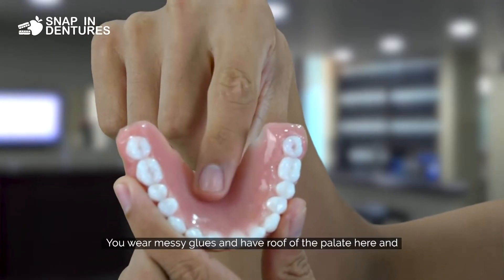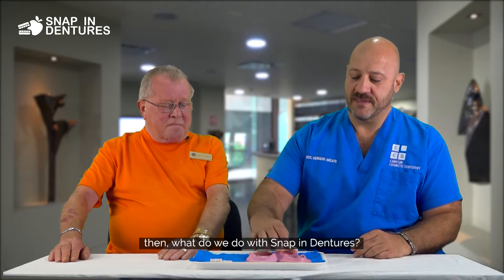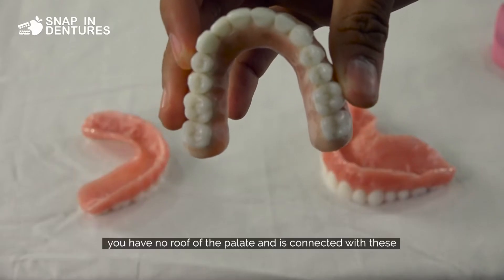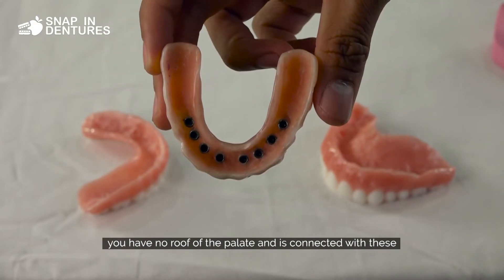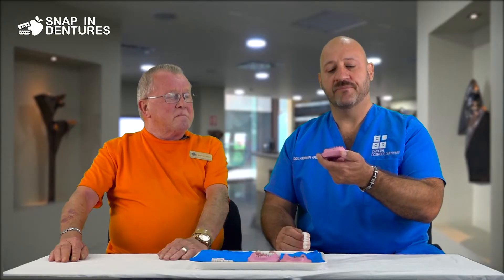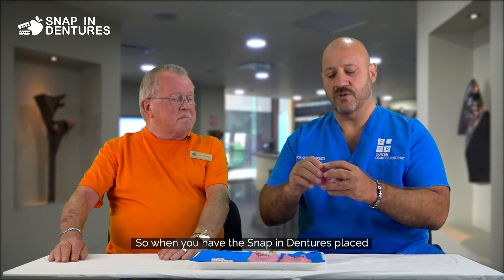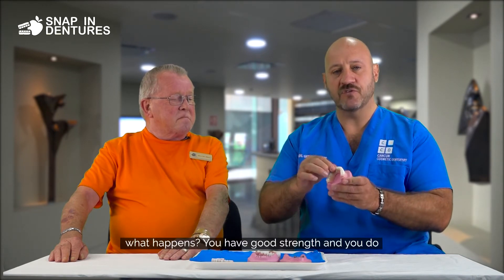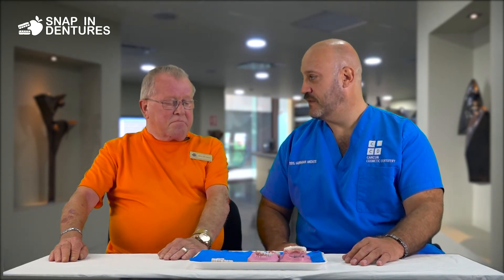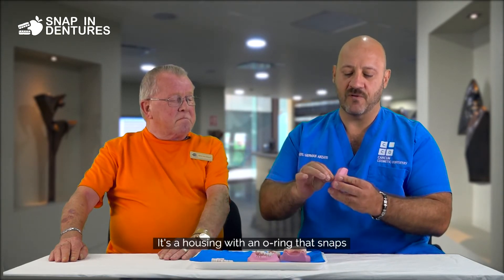When you have a regular denture like this, you wear messy glues and you have a roof of the palate here. With Snap in Dentures, this is the same thing but the only difference is you don't have a roof of the palate, and it's connected with O-rings, housings, and abutments. If they don't place eight of them, it's not Snap in Dentures. When you have Snap in Dentures placed, you have good strength and can bite and chew anything you want, like Gary says. The connection is a housing with an O-ring that snaps.